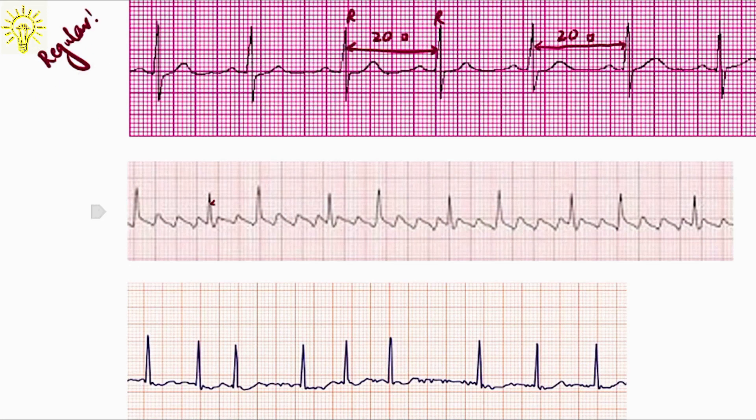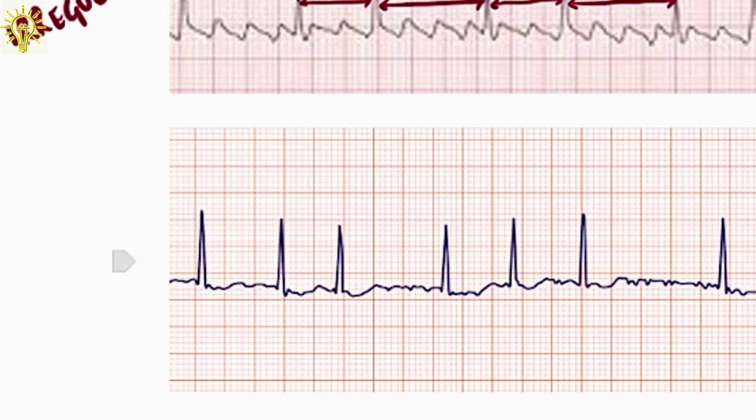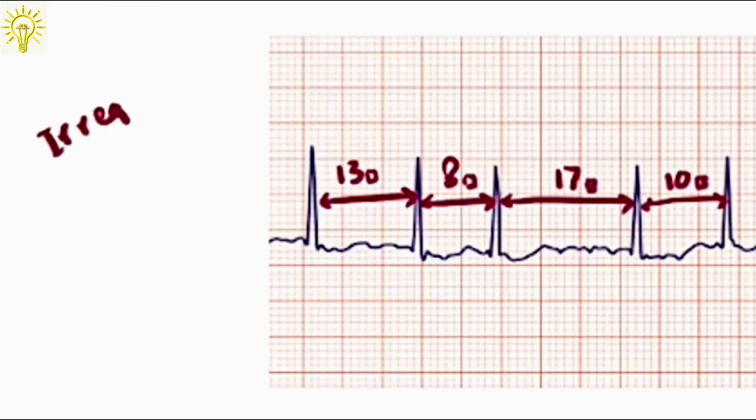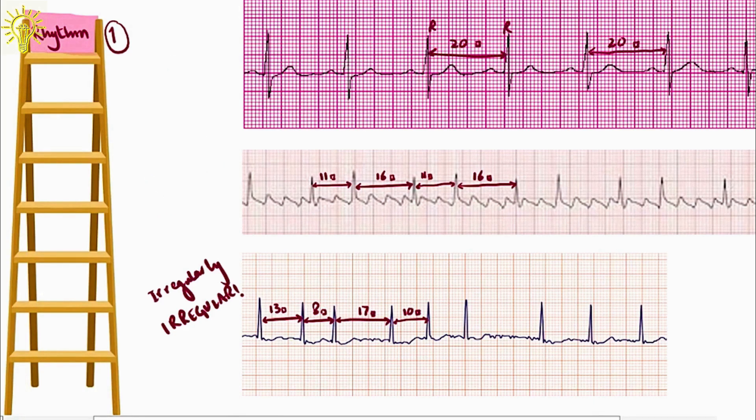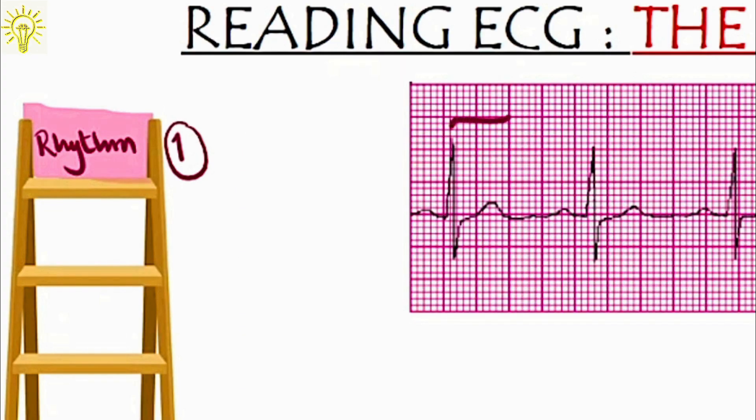In the second example, we have 11 small boxes between successive R waves followed by 16, followed again by 11, followed again further by 16. A regular pattern of irregularity, hence regularly irregular. In the third strip, every successive R wave interval is different with no pattern. So, we call it irregularly irregular. Note that the R wave is showing ventricular depolarization. For atrial side, we can do the same method for successive P waves.